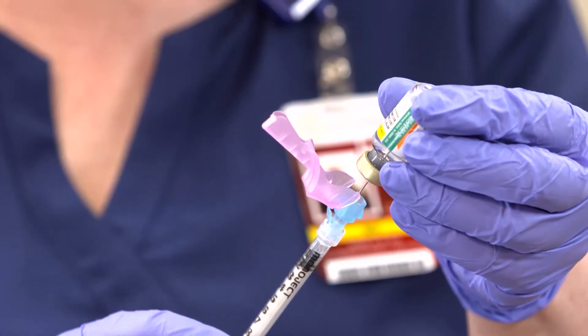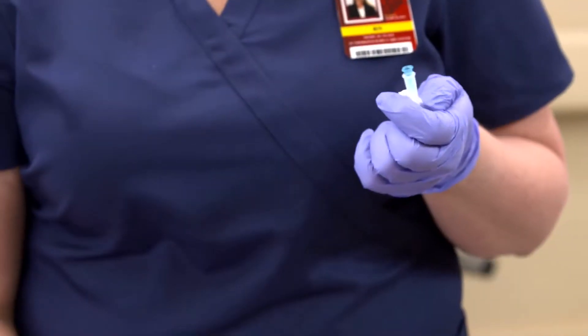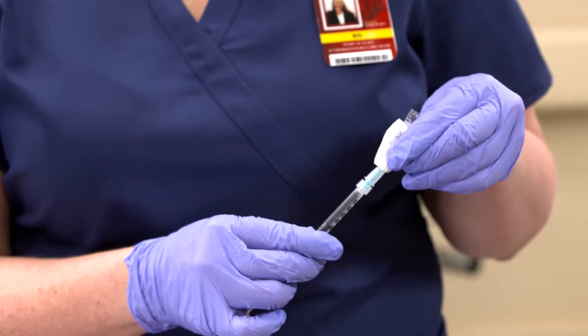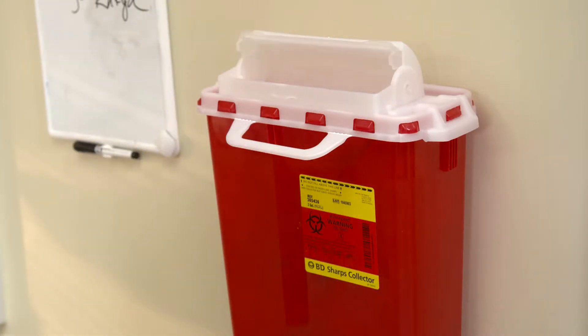Draw up 0.5 milliliters of the vaccine. Change the needle on the syringe to a 25 gauge, 5 eighth inch needle, which is recommended for neonates. Safely dispose of the 1 inch needle into a sharps container.